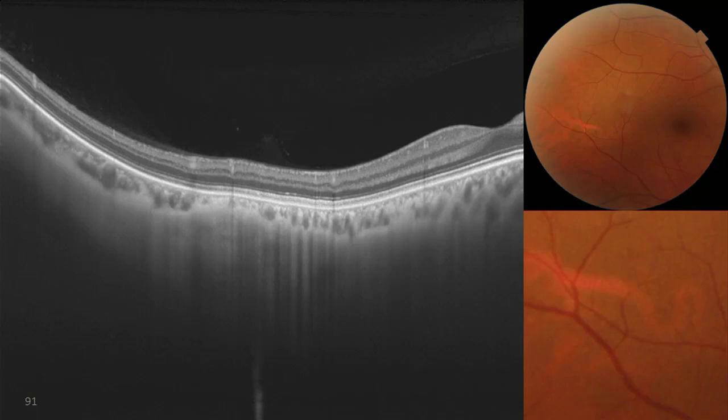Why this happens is a little unclear. One of the theories from Ricky Wang's group and Phil Rosenfeld's group is that these vessels don't have a muscle wall, so they expand and contract much easier, and that means that the speed of the flow of erythrocytes is different. These have a muscle wall and are a little bit more rigid, and that means that the flow speed and the flow configuration is different.